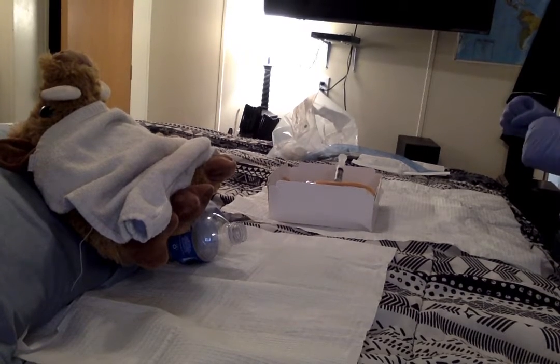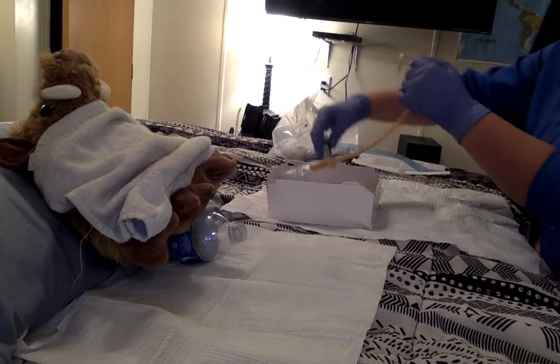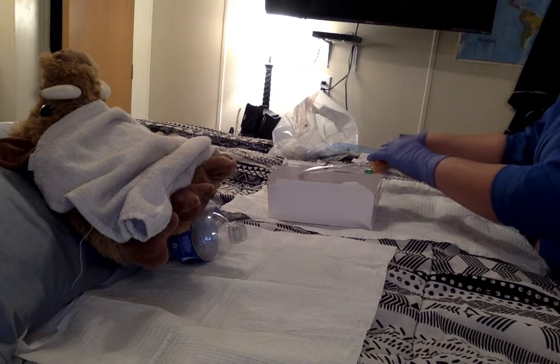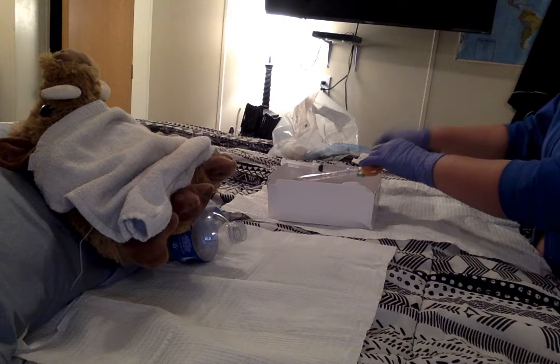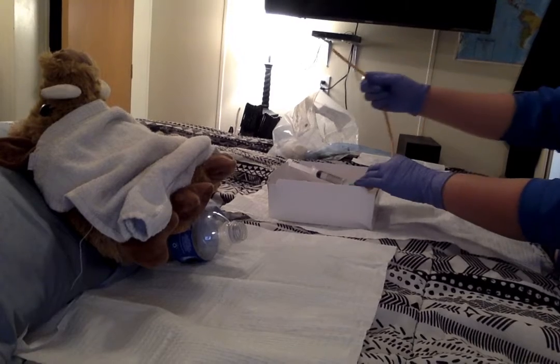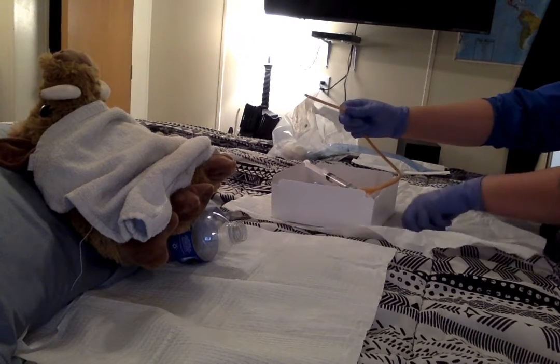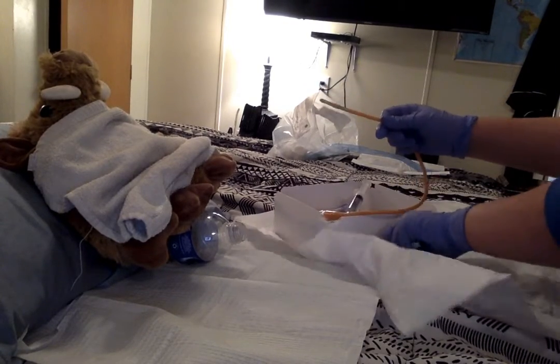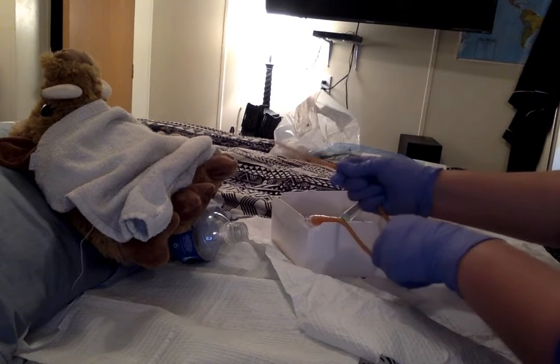Next thing we're going to do is we are going to grab our urinary catheter. We are going to make sure that we get this all lubed up, at least 1 to 2 inches. And then we are going to take the whole sterile field. We're going to get as close to the patient as possible, trying to keep everything sterile. And we're going to insert the catheter.